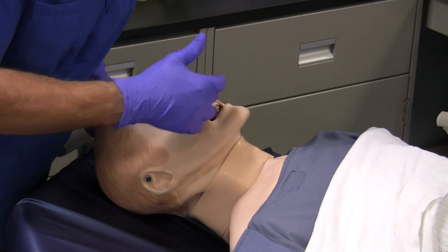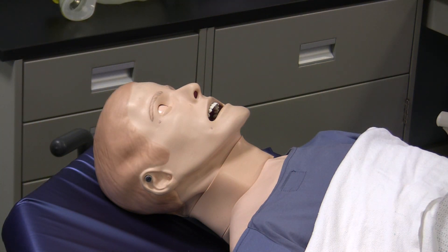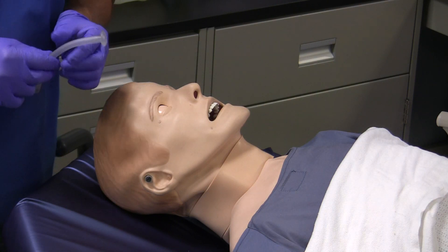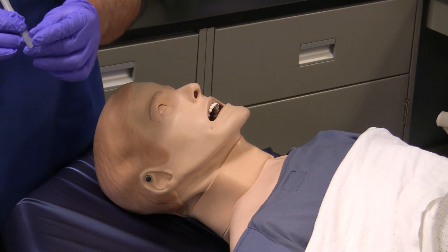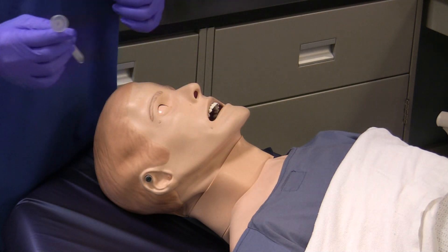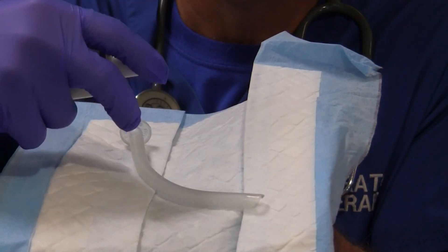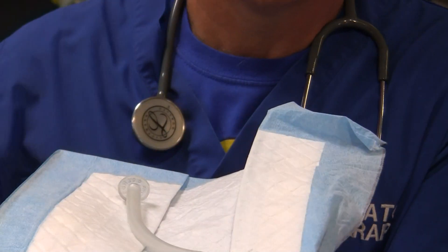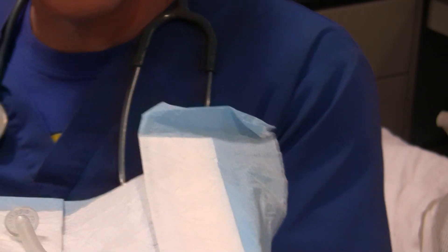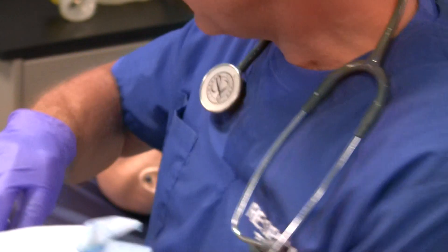So looking at this person's nare, I'm checking for any septal deviation — and I don't see any. I'm looking at the size of the patient's nare. I need to grab the appropriate airway that will facilitate both length and diameter. I'm going to take this airway, size it, and it looks like it's the right size. The diameter also looks correct. Now I'm going to lubricate it. To lubricate the nasopharyngeal airway, you only need to lubricate the distal end — not the whole airway, because if you do it'll be hard to hold on to. I'm just going to put some lubricant on the distal portion that will slide through the nares first, and that lubricant will travel with the NPA all the way down into the patient's airway.